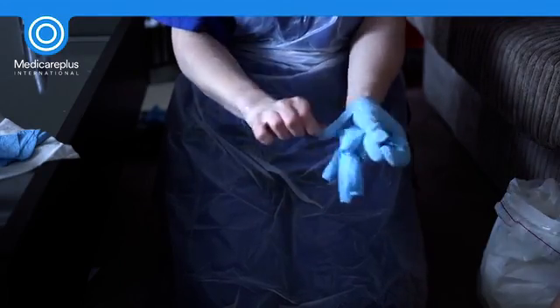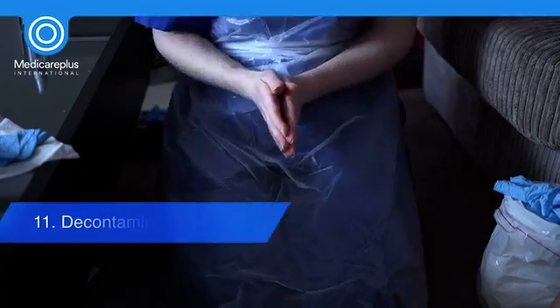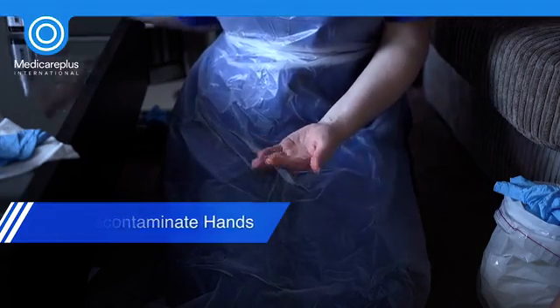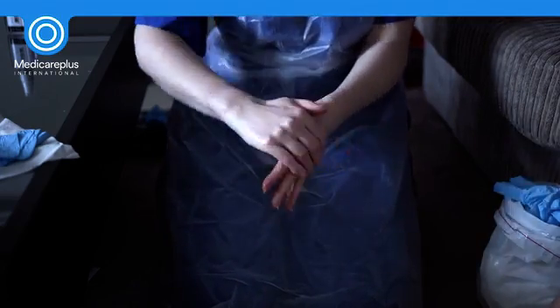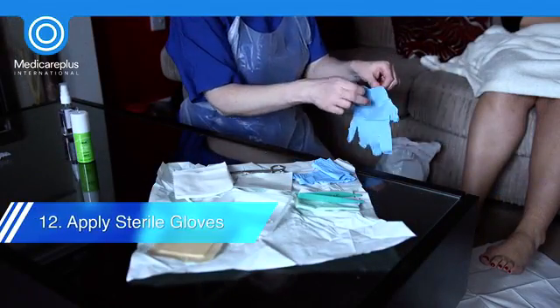Once cleansing is complete, remove your used gloves. Following glove removal, it is considered best practice to wash hands with soap and water. Hand cleaning wipes and/or alcohol gel can again be used if the facilities and environment are unsuitable. Now apply the sterile gloves from the dressing pack.